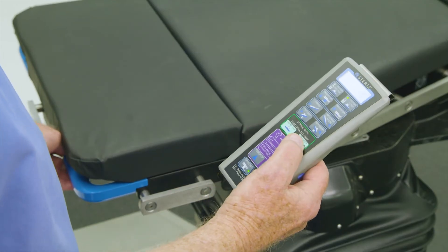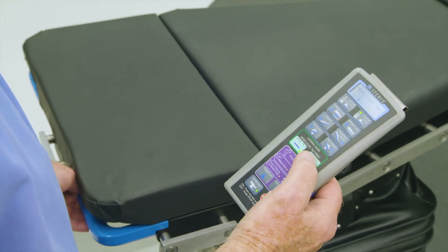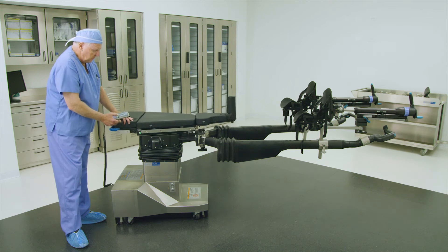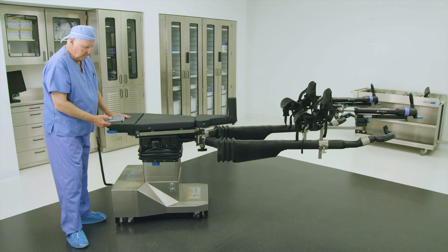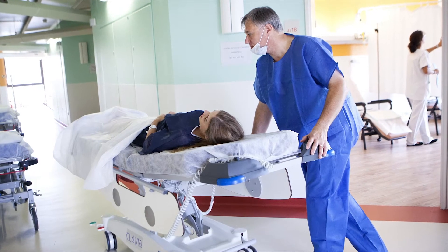Alternatively, the tabletop can be translated by unlatching the lateral slide through the buttons on the primary hand control. Press and hold the green unlatch button on the hand control, and then physically push the tabletop laterally left or right until it locks in position. The table is now ready for patient transfer.